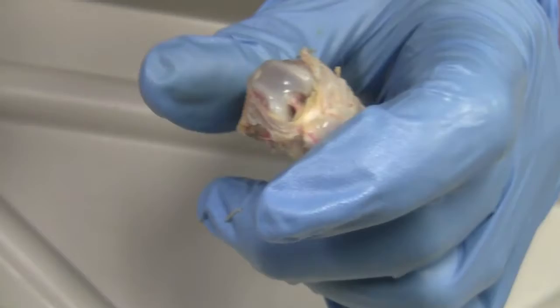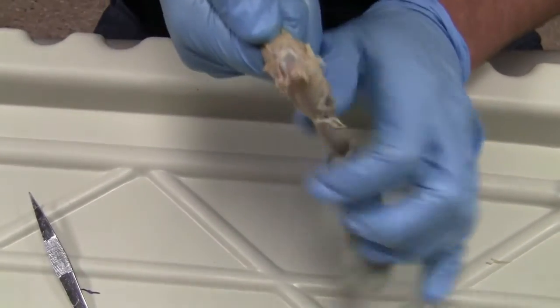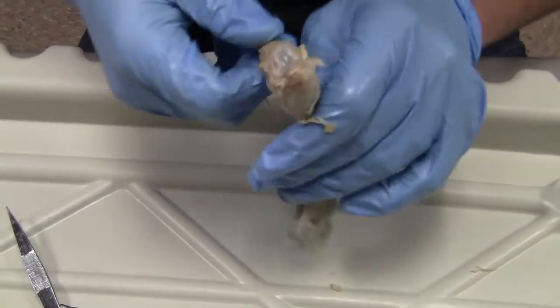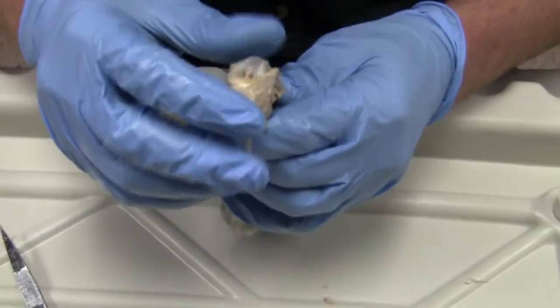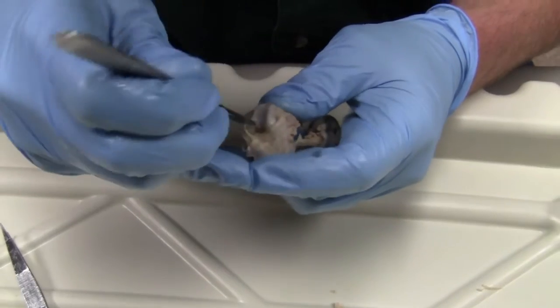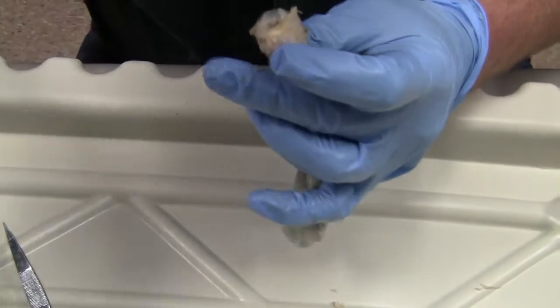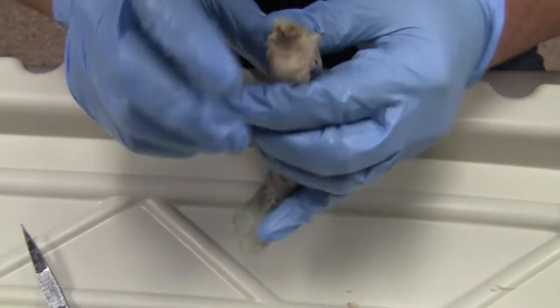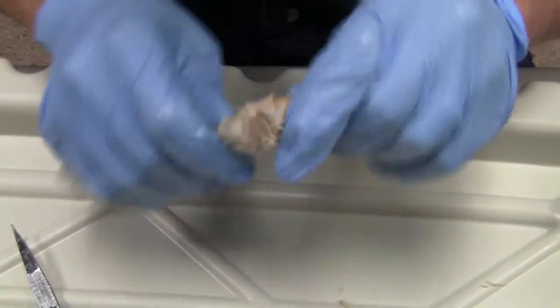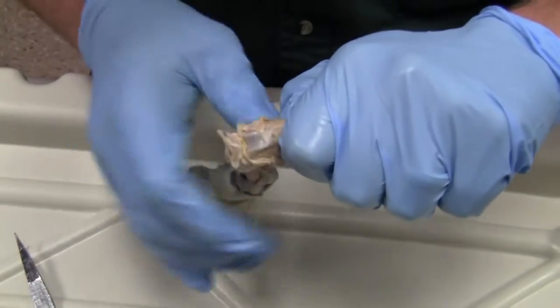So that is there. What the cranial cruciate does is it basically stops your tibia and fibula from moving cranially. So that way would be cranially, see it doesn't move at all. And what you want to do is hyperflex your knee and take your scalpel and just carefully cut your cranial cruciate. I didn't cut it all the way. Now I cut it. So they're going to do the anterior drawer test again.